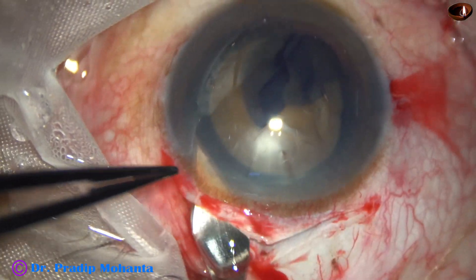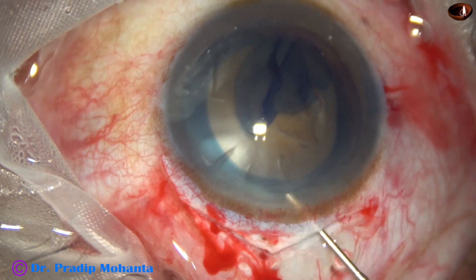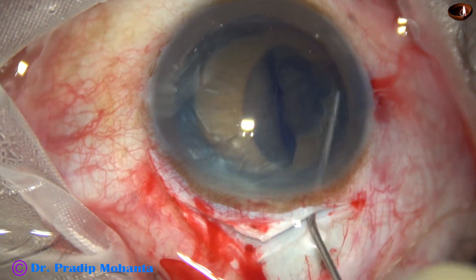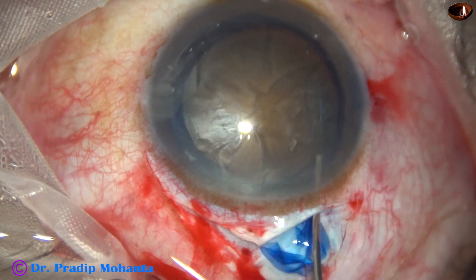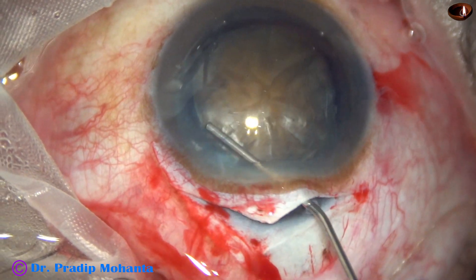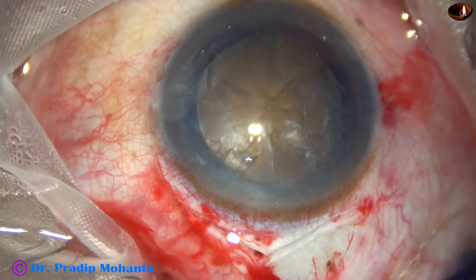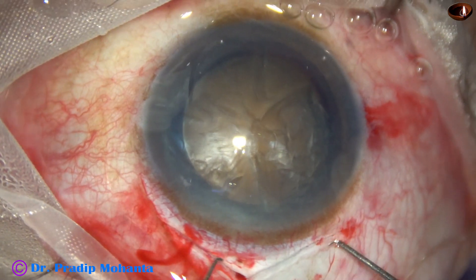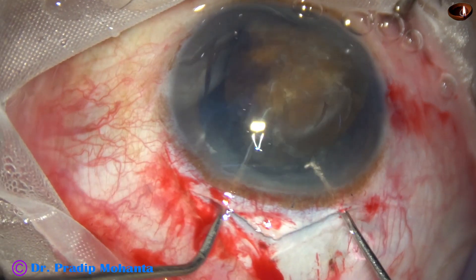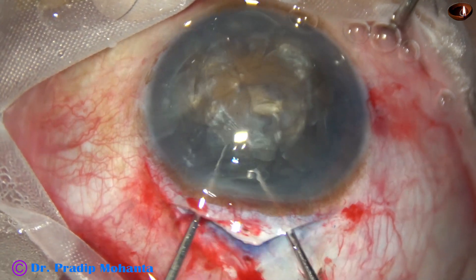We must cut when we go forward — during forward movement only we cut the tissue. Now hydrodissection is done. The nucleus is tapped. The nucleus is huge; it didn't come out of the capsular bag by hydrodissection. So after injecting viscoelastic, I take two hooks and the nucleus is dialed out of the capsular bag.